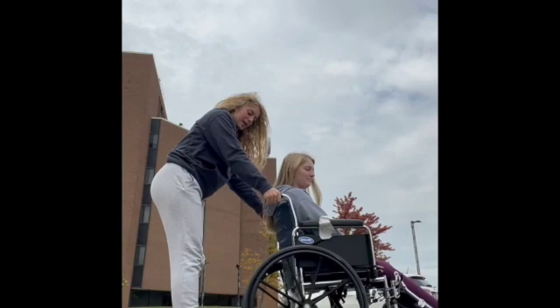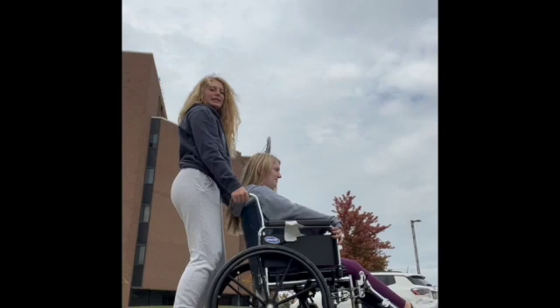To bring a patient up a curb going backwards, back the wheelchair up as close to the curb as possible, use your abs, bend your knees slightly, and pull the wheelchair up. Then pull up again to get fully onto the curb.